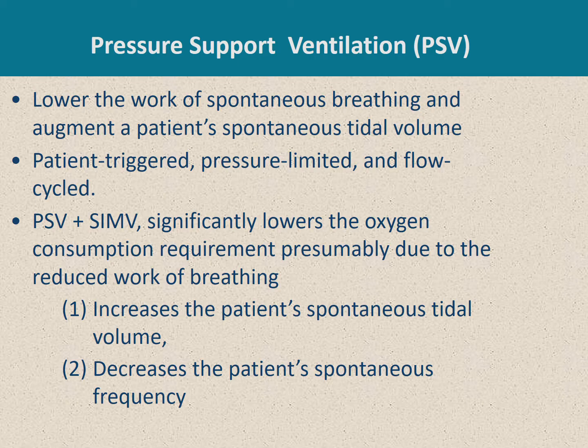After he inspires, the ventilator delivers a set pressure that you will set, either 10 or 20 centimeters of water. This pressure helps the patient to inspire, and the flow of inspired air is monitored. After the decline of flow at the end of inspiration, the ventilator cycles to expiration.